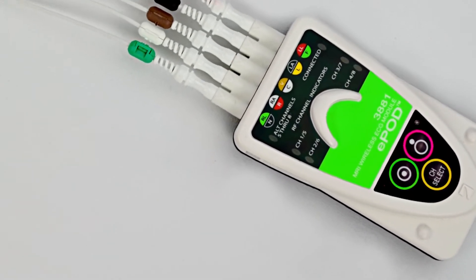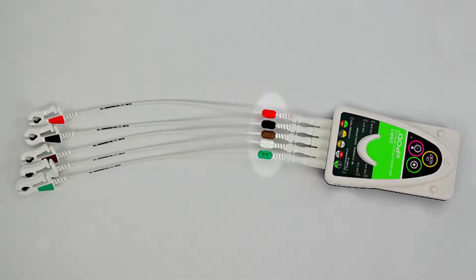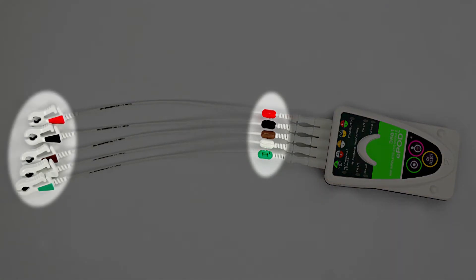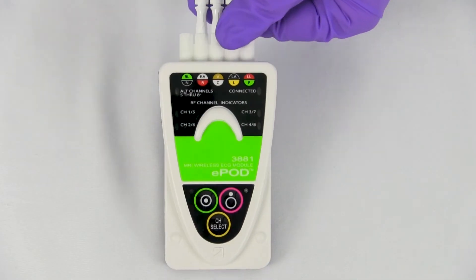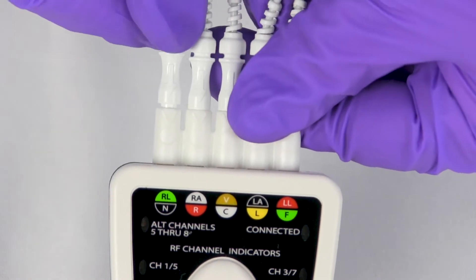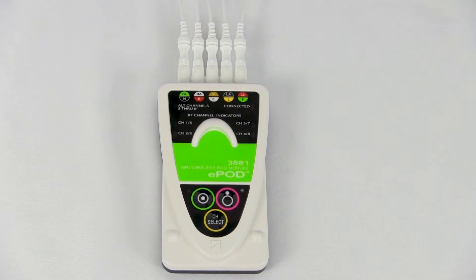The Iratamed 3880 monitor system's ECG EPOD has a five-lead system. Each lead has a color-coded bead on the wire, as well as a matching indicator on the lead's clamp for the user's convenience. To connect each lead to its corresponding port on the EPOD, simply line up the arrow on the lead wire to the V on the EPOD and insert until the lead wire is flush with the EPOD.